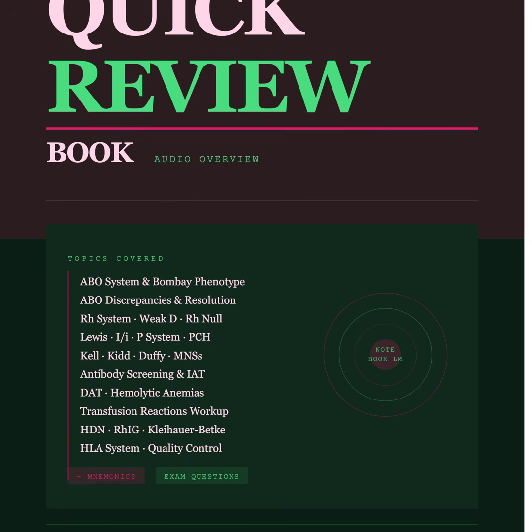They definitely do. Let's tackle rouleau first. I'm looking at the discrepancy resolution chart, and I have a question about the protocol. If rouleau affects both the red cells, causing front-type problems, and the serum causing back-type problems, why do we treat the resolutions entirely differently? What do you mean? Well, the chart states that for red cell problems, you resolve by repeating with saline-washed cells. But for serum problems, you must use a saline replacement technique. Why the discrepancy in resolving the discrepancy? That is a phenomenal question, and understanding the physical difference between those two techniques is absolutely critical.